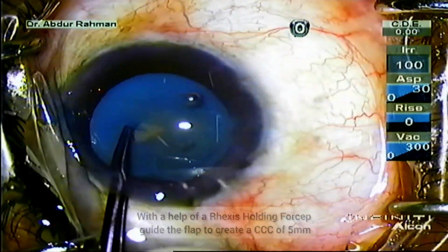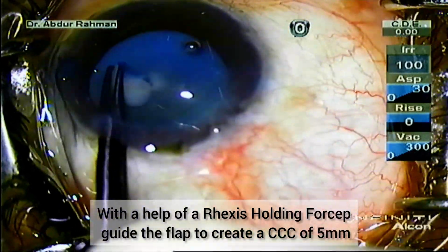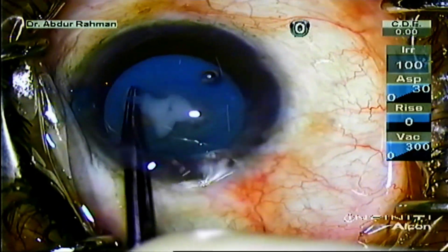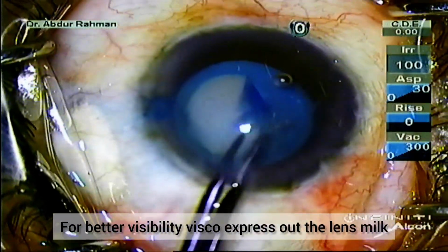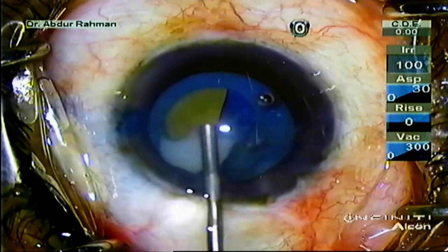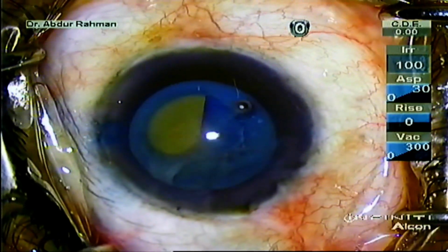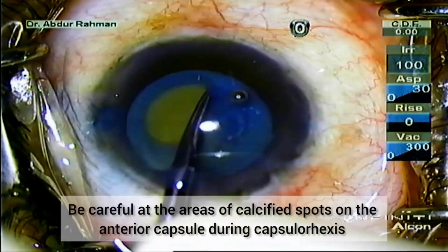Now refill the anterior chamber with OVD, and with the help of rhexis holding forceps, guide the rhexis flap in a circular manner to create a continuous curvilinear capsulorhexis. This liquefied cortex sometimes comes out; viscoexpress it out for better visibility.